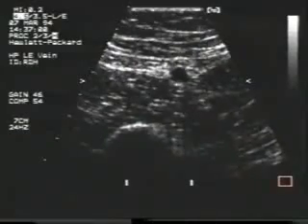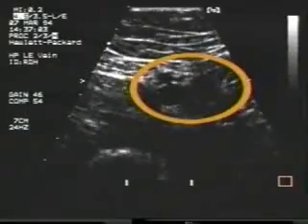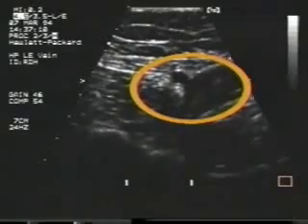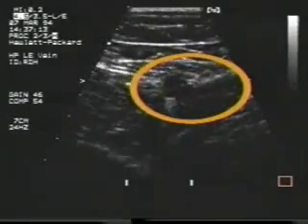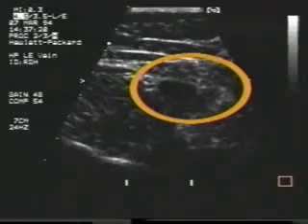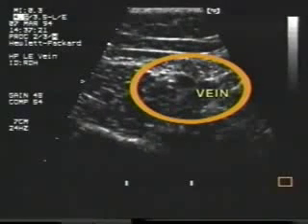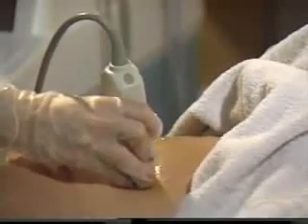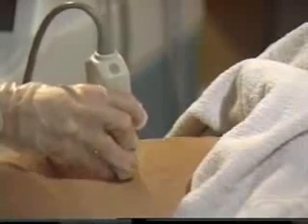As you go down the leg in the transverse view, evaluate each segment for compressibility. Direct compression techniques are best performed in transverse, because in the longitudinal plane you can't see if the transducer has slipped off the vein. Just compress lightly with the transducer — the walls coapt or touch as they completely compress and disappear. When you release, the vein is larger. Compression is also an easy way to differentiate between an artery and a vein: the vein will normally compress, while the artery will not. Repeat this maneuver every 2 to 3 centimeters along the length of the vein in the transverse view.